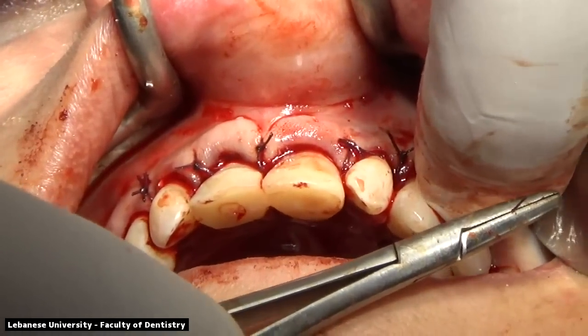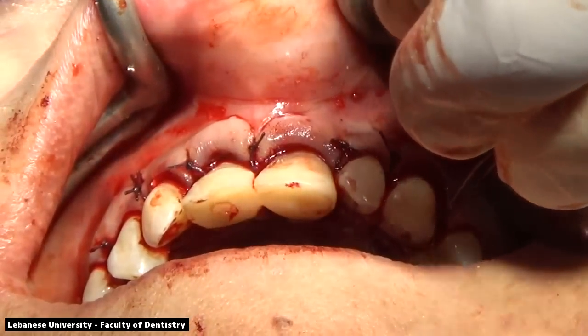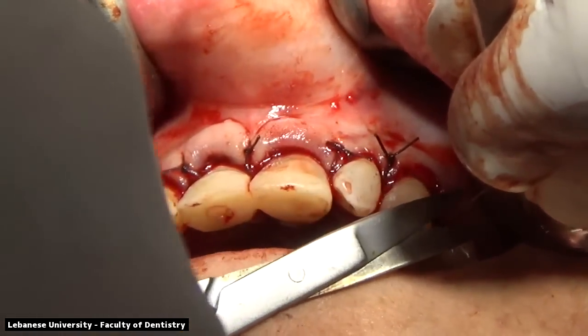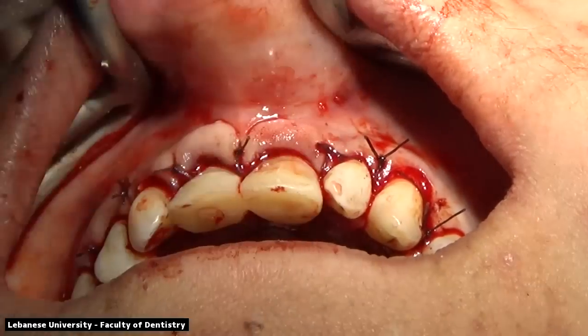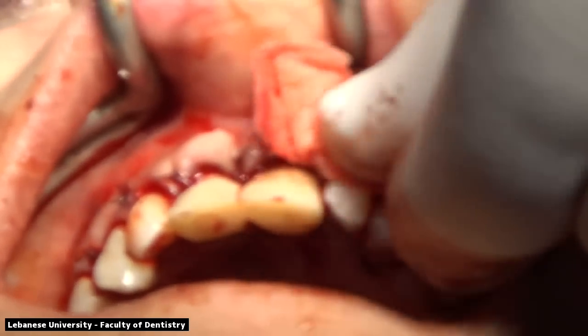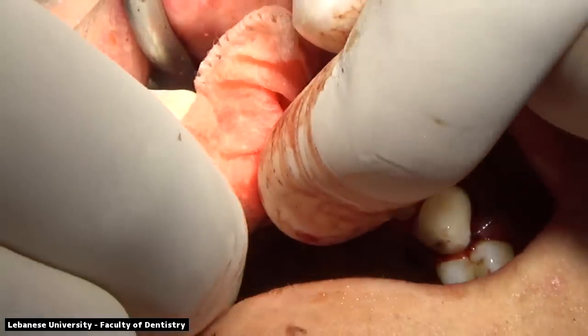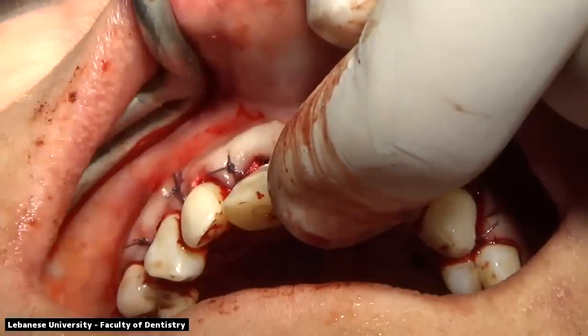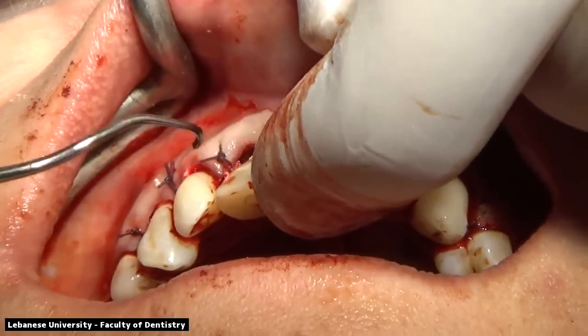You can see the tight adaptation of the soft tissue on the 2 central incisors that were restored with the implant restorations right now. And there is no gap in between the soft tissue and the provisional restorations. The bone graft has been completely contained inside the socket area, contained between the implant body and the buccal plate of bone, with the complete closure of the mucoperiosteal flap, having the periosteum completely intact, which will support the healing of our buccal plate of bone and our bone graft material and the implant.